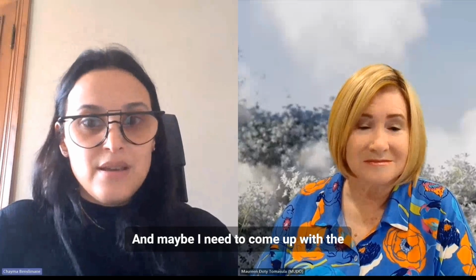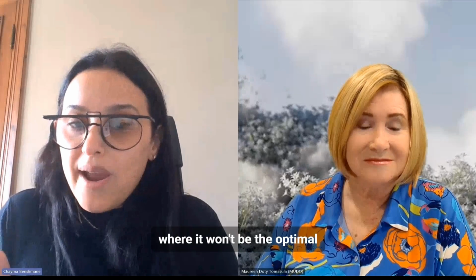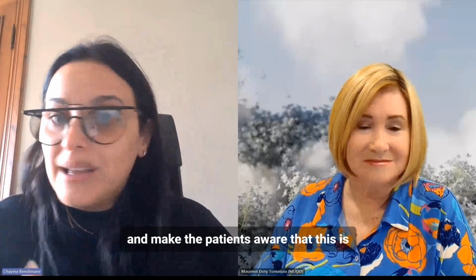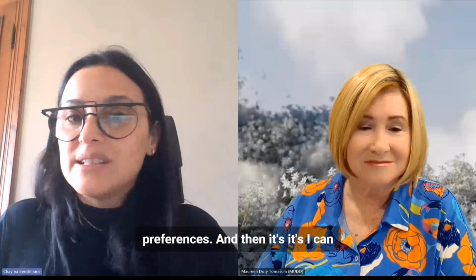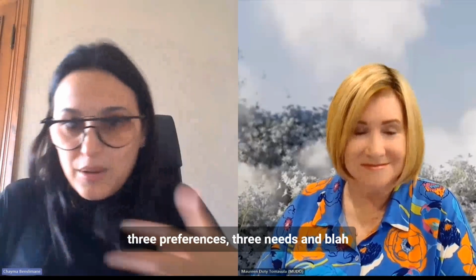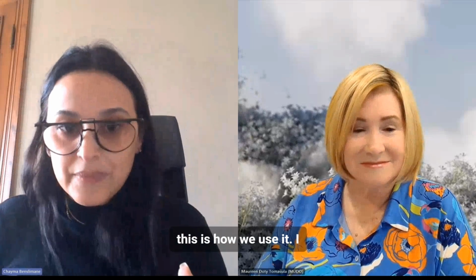And maybe I need to come up with a second one, but at a second stage, where it won't be the optimal option, but it would be the second option. And make the patient aware that this is not the optimal option, because based on the preferences and the needs, I can only have one solution that would cover all this, right? With the three preferences and three needs. So this is how we use it.